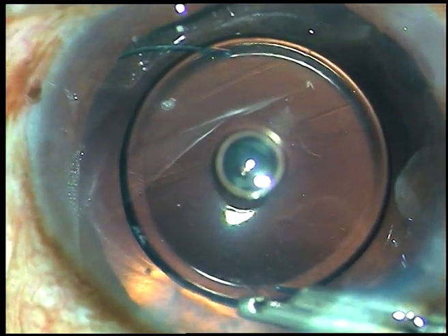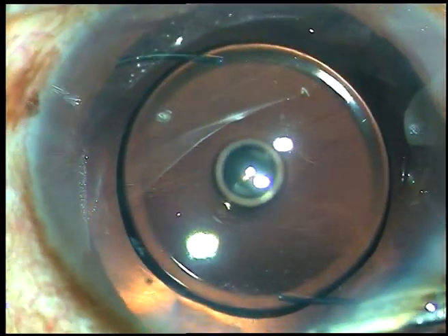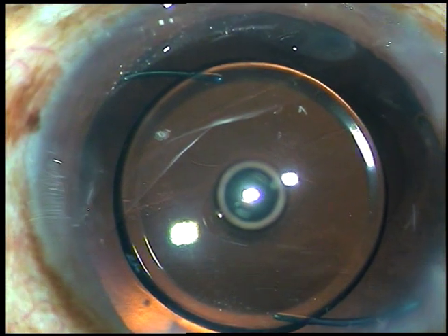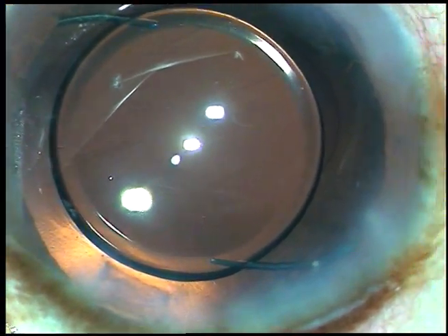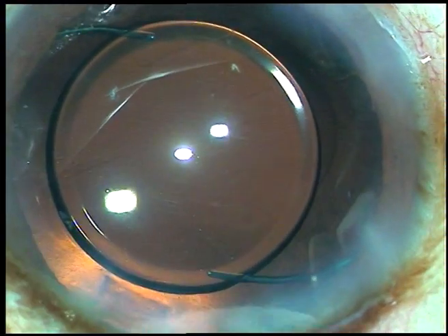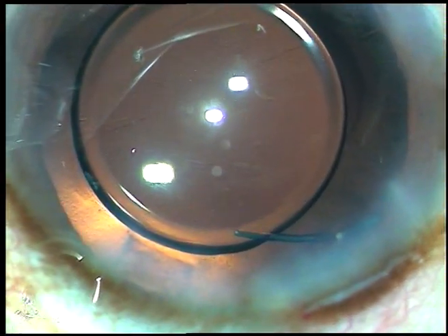I followed up this case after six hours and the patient was doing very well — the cornea was clear, there was no corneal edema, and the chamber was very quiet. The case is managed well. Thank you very much for watching. Hope this video will help you in developing your surgical skills.